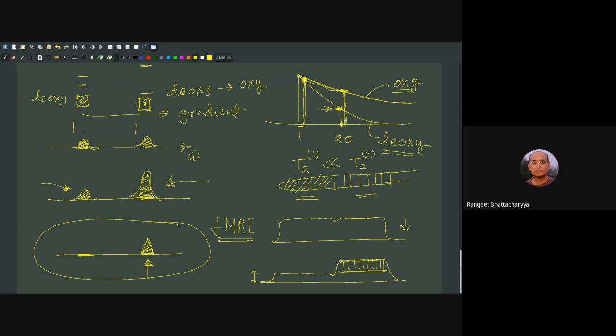Maybe you put a mirror there, non-magnetic material, so no metal, and through the mirror the person can see a picture at the back of the room far away, where you can change things and make sure the person has attention on the picture.